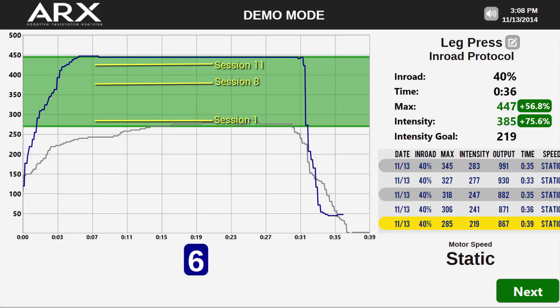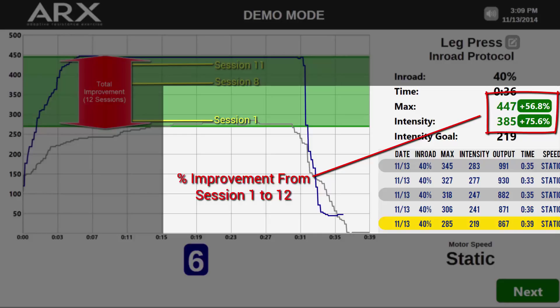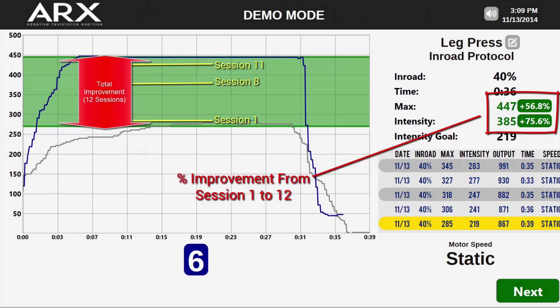One of the foundations of physical rehabilitation is that the strengthening of the muscles improves the joints that support those muscles in the process. With our technology, you can now show quantified and undeniable proof of improvement to your colleagues, to your patients, and most importantly, to the insurance company. Keep in mind that this is just a demonstration — different practitioners will recommend different protocols for different patients — but what we're clearly showing here is that ARX represents a completely safe, extremely efficient, and precisely quantifiable rehabilitation tool.